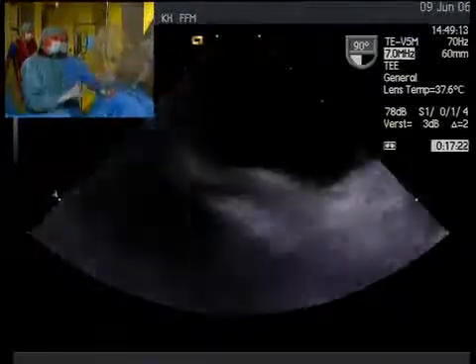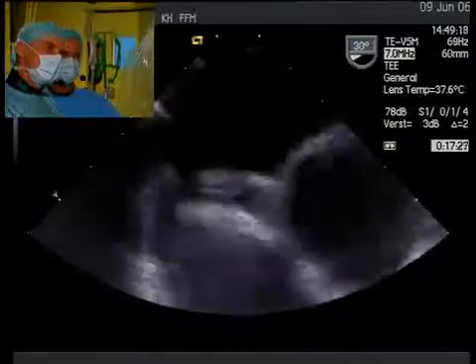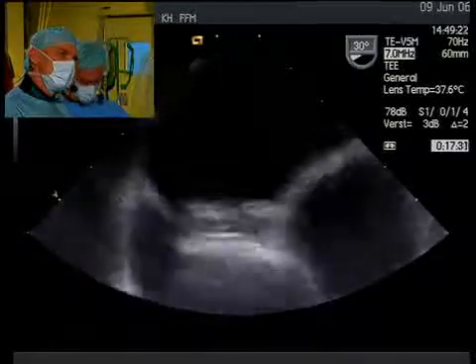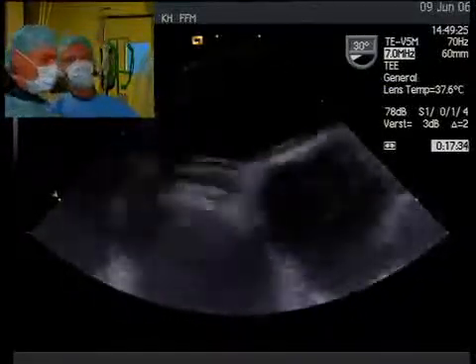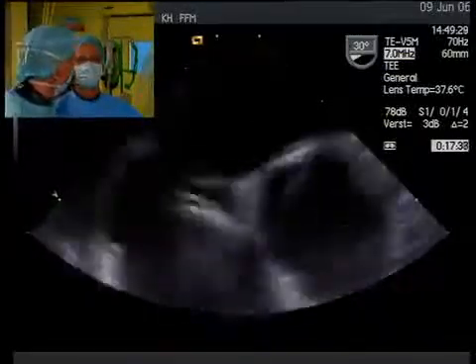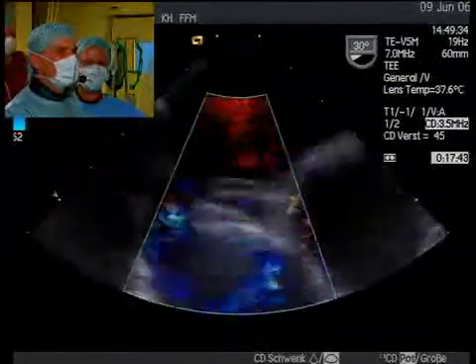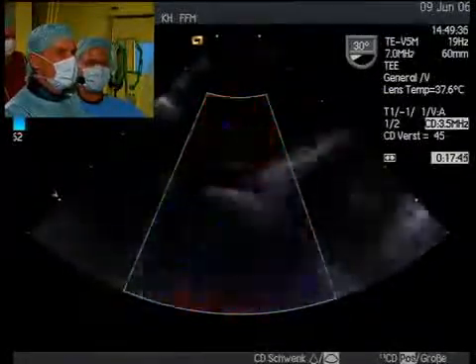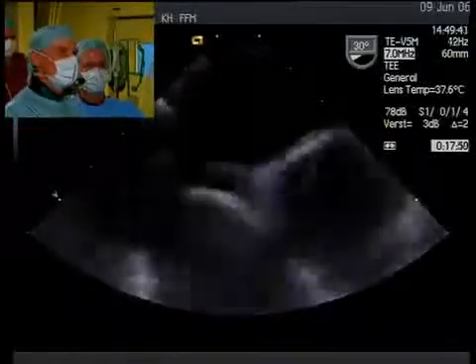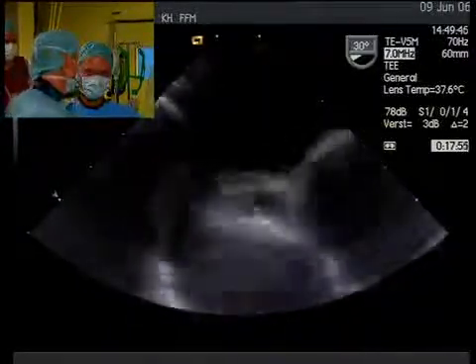The adaptation to the heart shape is very nice. And what is the cost projected to be? Well, 10% of the price of the AGA devices. I can't say right now because we are in the clinical trial, and actually this was the first case I did — and Horst will cooperate in this trial, so it's his first case then.